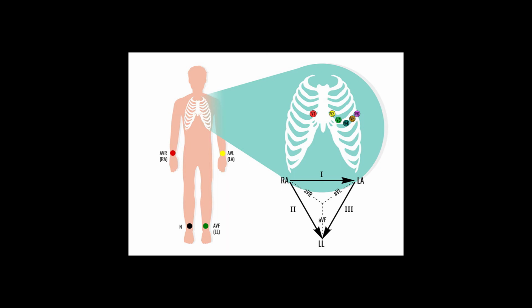Electrodes are actually conductive pads attached to the body's surface. Any pair of electrodes can measure the electrical potential difference between the two corresponding locations of attachment. This pair forms a lead.